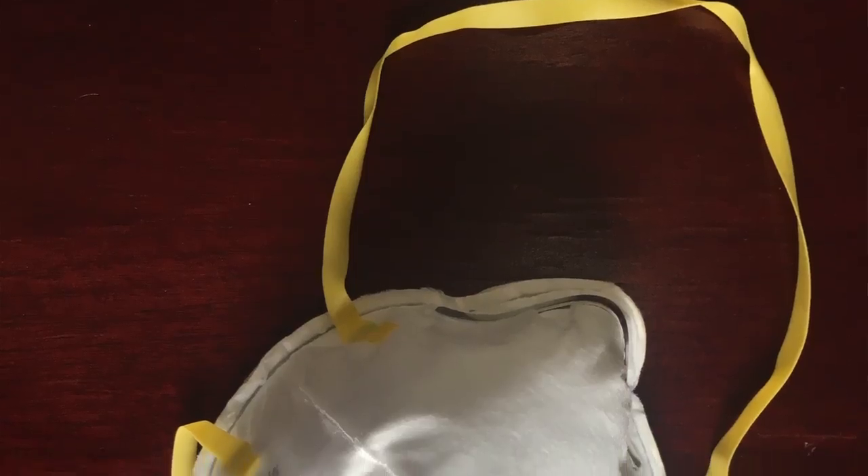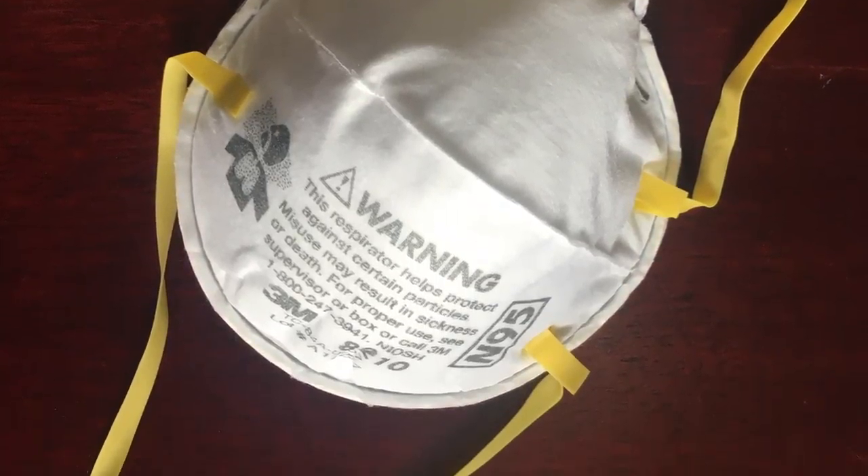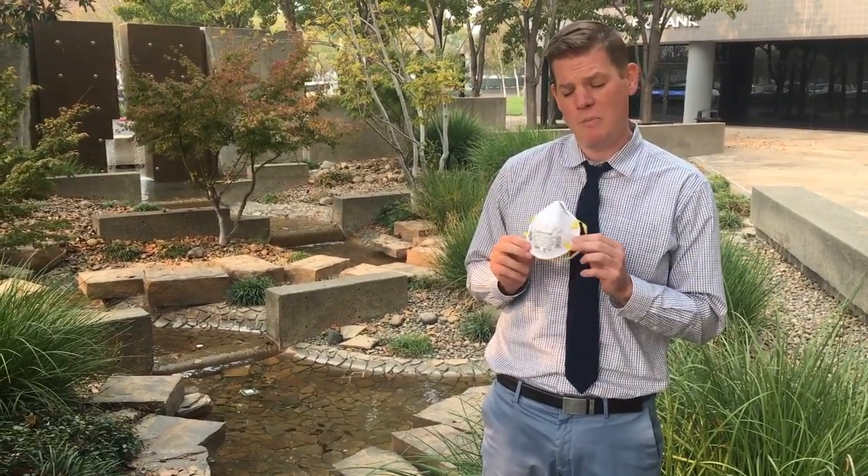A respirator, when used correctly, can help filter the air and make it safe for you to breathe. N95 respirators cannot be used in atmospheres that have asbestos, that don't have enough oxygen, and they're not good at capturing chemicals or vapors in the air. They are good, however, at capturing smoke particularly.